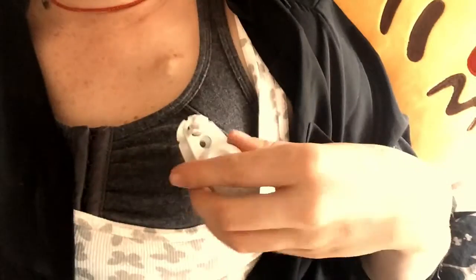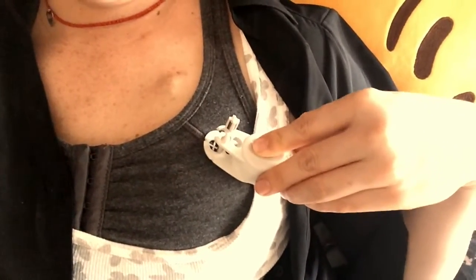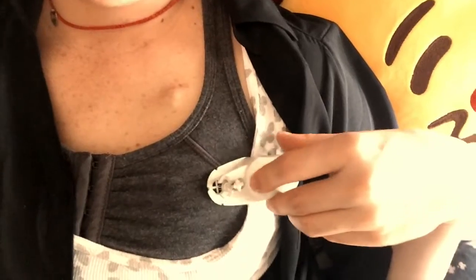It shows you where the magnet is — well, not you, but the nurse. They use it to find the magnet, which tells them where to put the needle and inflate my tissue expander.